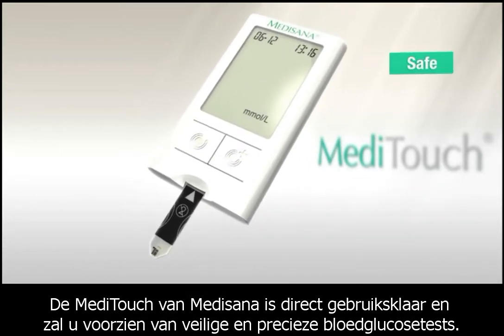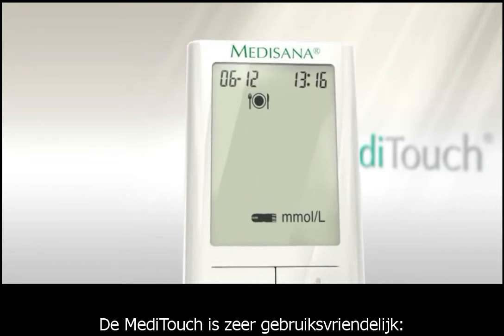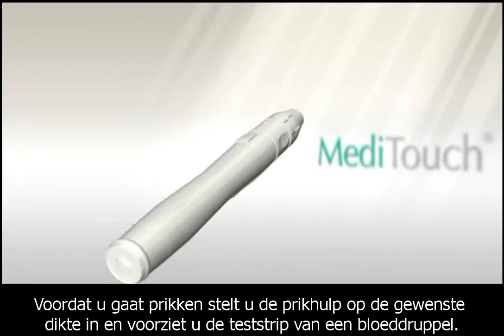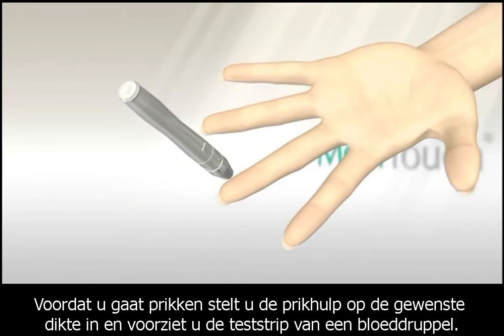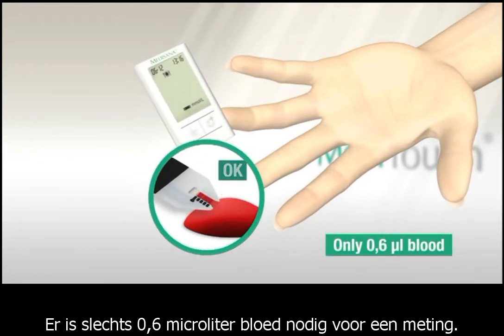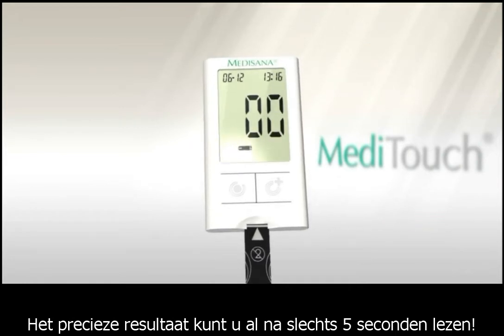The Medisana Meditouch is immediately ready to use to provide you with a safe and accurate blood glucose test. It is very easy to use — you can set the lancing device to your individual preference before pricking and absorbing the blood into the test strip. A tiny 0.6 microliters of blood is all that is needed, and you'll get a precise measurement in just 5 seconds.